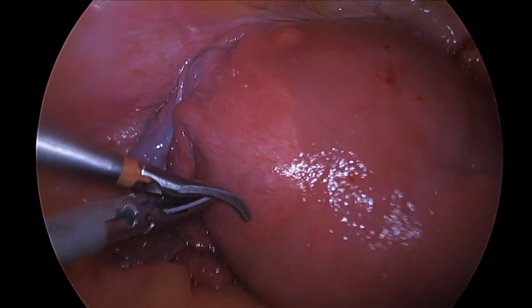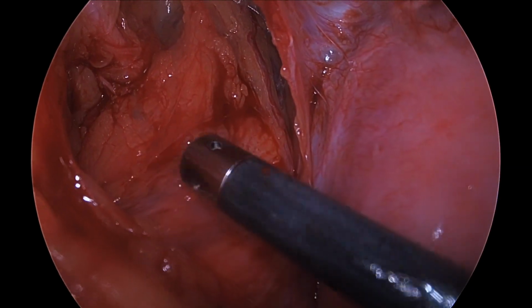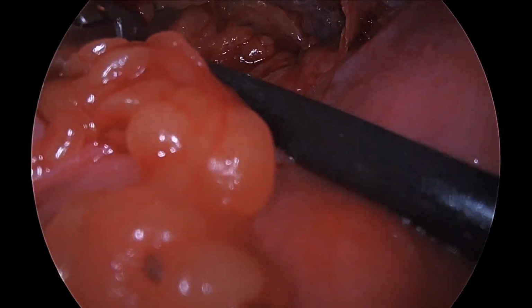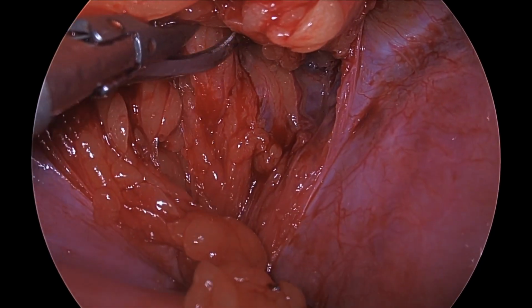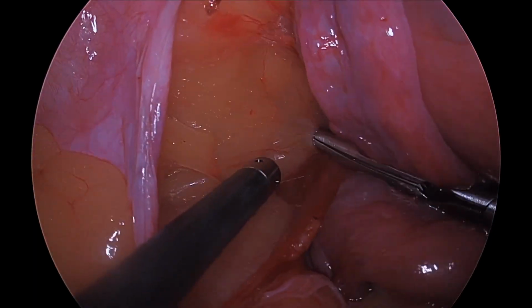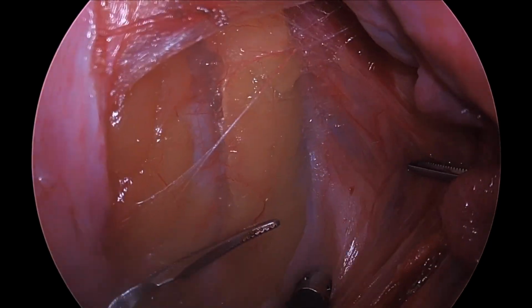Note the extensive vascularity and 9-week gravid size of the uterus. Again, we started with an anterior approach, dissecting the paravesical space, noting the location of the uterine artery. Again, the adiposity and vascularity made dissection challenging. We proceeded with a lateral approach to the ureter and internal iliac artery on the left. The artery was isolated with great care and a bulldog clamp was placed without complication.